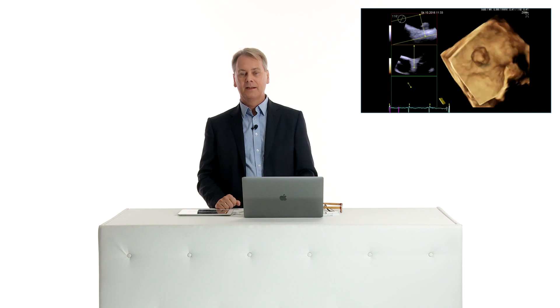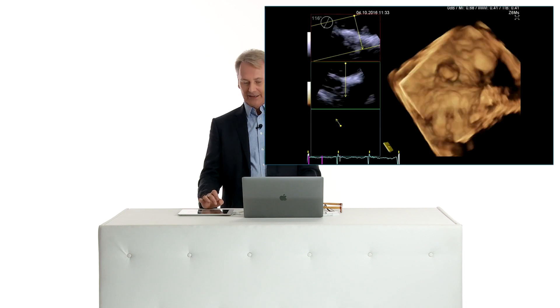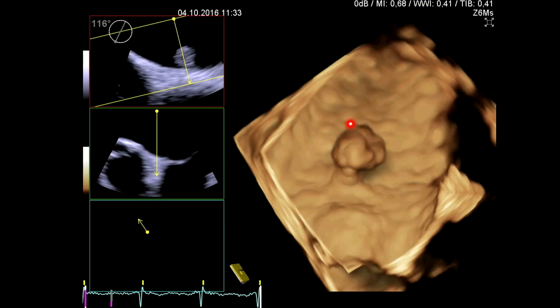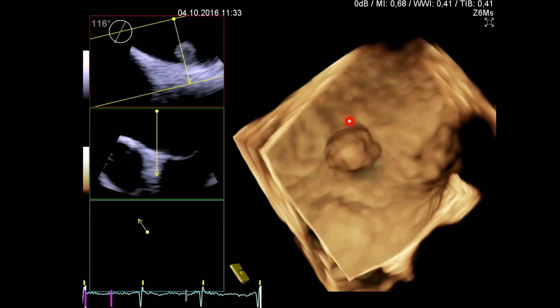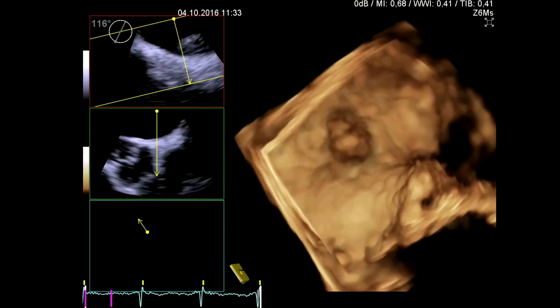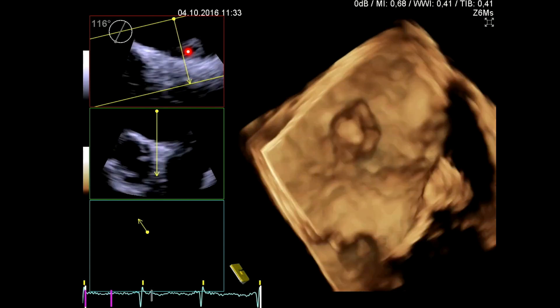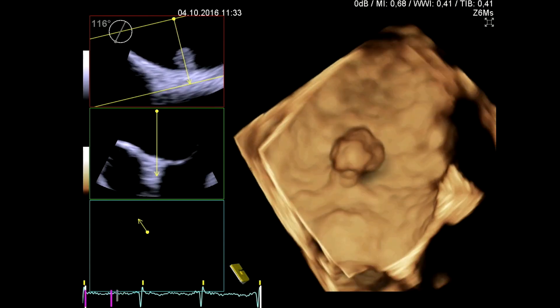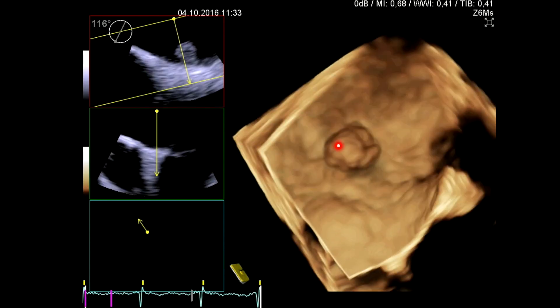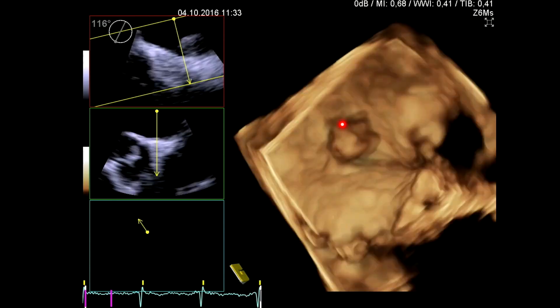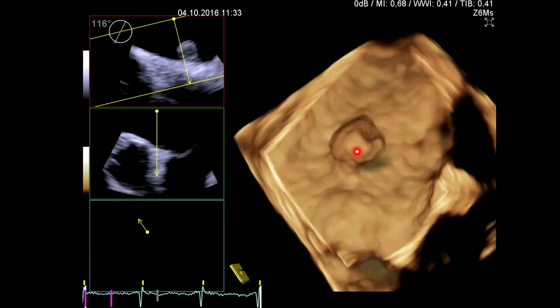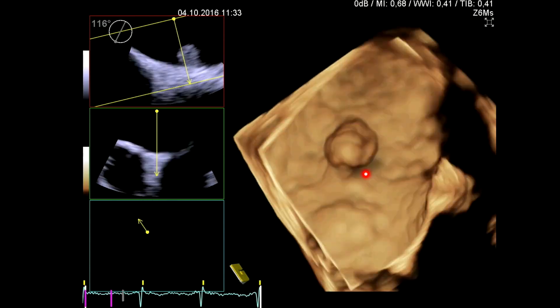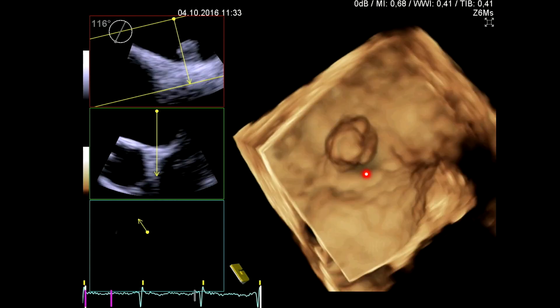Tumors and masses. This is a patient who had a myxoma, a very small myxoma. You can see that on 2D echocardiography very nicely, but the nice thing is that you can really see the shape of the tumor and how it is pedunculated with the help of 3D.